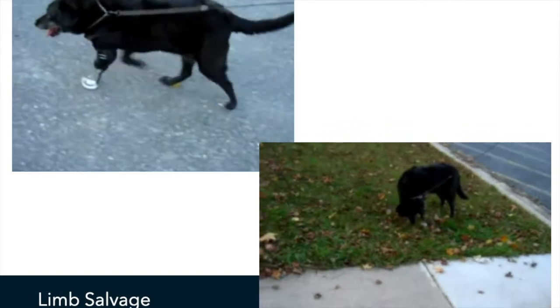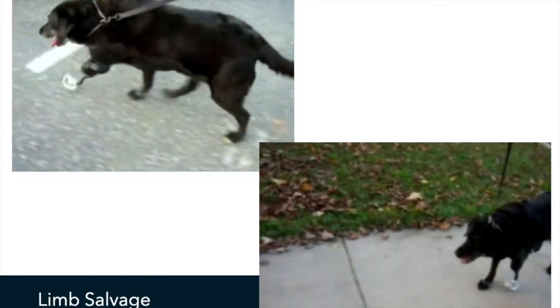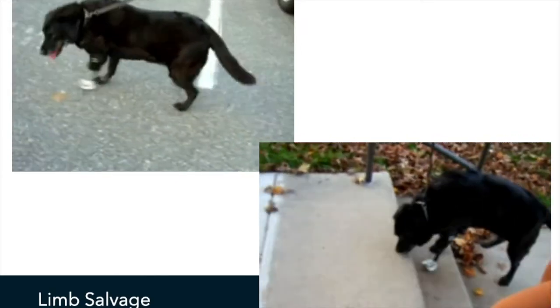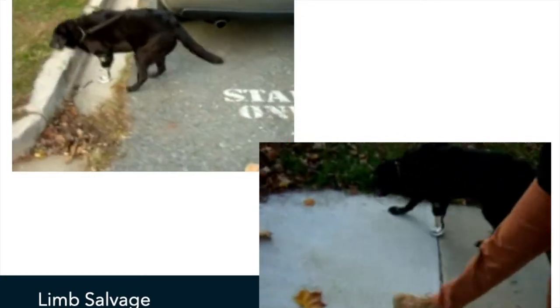Now the most challenging thing is, can they ambulate and navigate stairs? So here's an example of Ebony with our first stairs. So not too bad. Okay, again, this is going to take some work. It's going to take some training. It's going to take patience, but again, the right patient and the right owner.